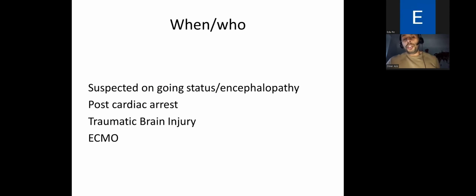So the next question is, who do we put our CFAM on? We put it on for any patient who's intubated and ventilated with ongoing status epilepticus, or who's got encephalopathy, post-cardiac arrest patients, ECMO patients, because we know that they're at risk of having seizures and cerebral dysfunction, and also traumatic brain injury as well.